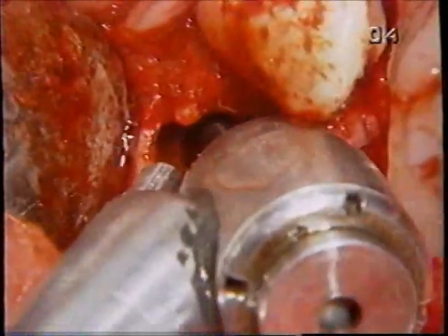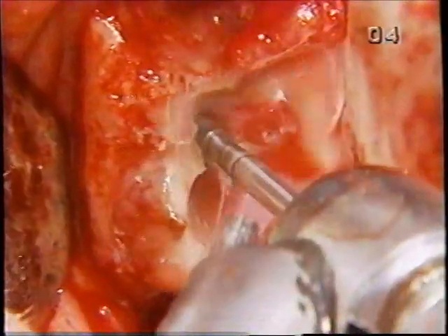And the way we do that is we need to have the right instrumentation. We need to have ideas in the back of our mind of, if this doesn't work, well, that's okay because we can do this. We have a different instrument. We can remove a little more bone in a certain place. We can do something to the tooth, maybe a section cut, maybe a purchase point. We have not only plan A and B, but we have C and D, and then on through the alphabet, so that there's lots of options available to us. That's the only way these extractions will become predictable.